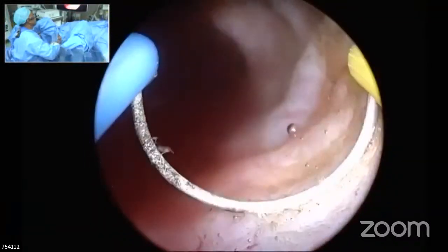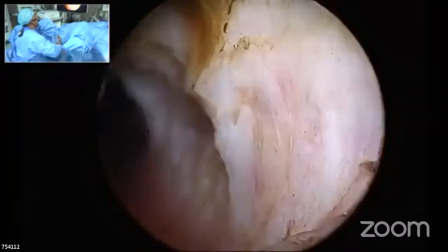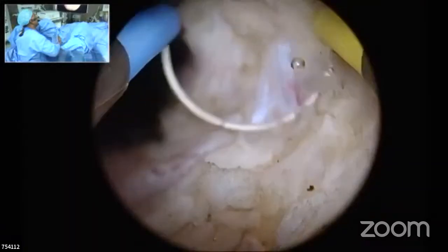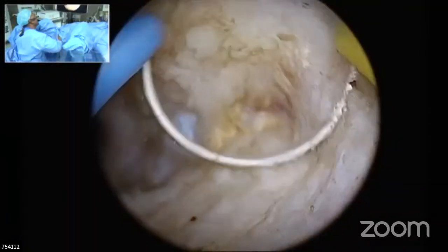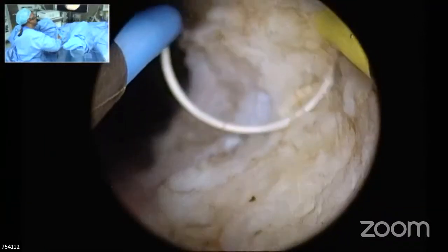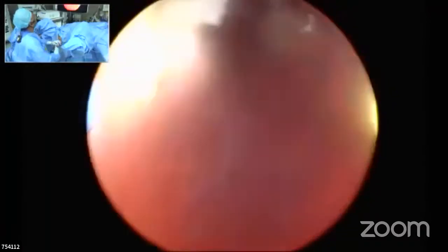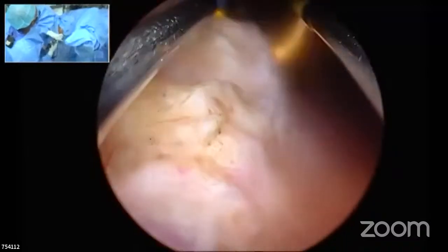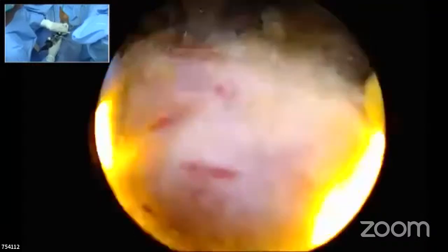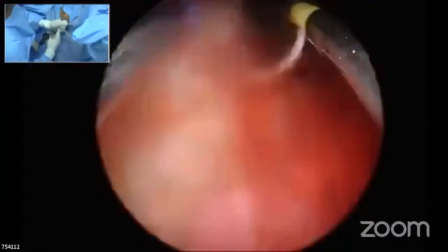Sir, that's exactly what I say. In the majority of resectoscopes which have a beak-like thing, that beak will compress those areas and they don't bleed when the resectoscope is inside. When you withdraw the resectoscope, then only they start bleeding. So majority of the times the bleeding is in the roof, because it is compressed by the beak of the resectoscope during a normal resection. So I always tell people, look for the roof and then decide, and then finish the resection. Never say that the hemostasis is complete without looking at the roof. What do you say, sir? Absolutely correct.